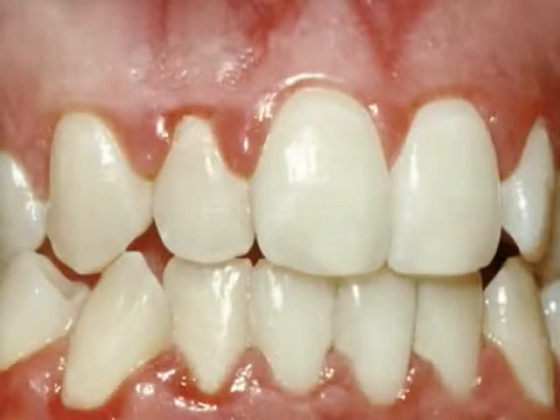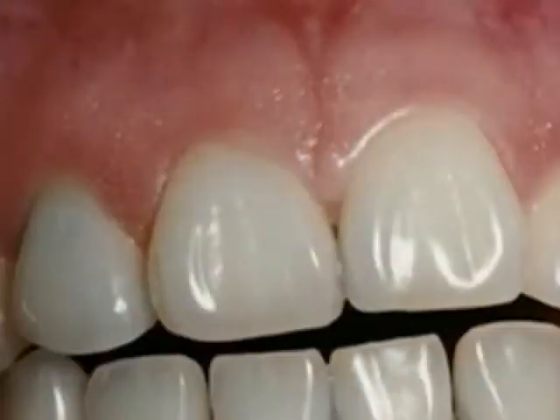Scaling and root planing removes the source of infection, helps your gums heal and tighten around the teeth, and gives you back your healthy smile.